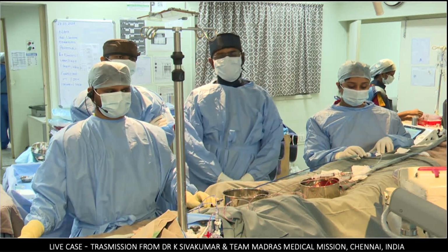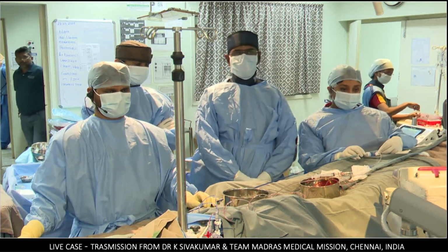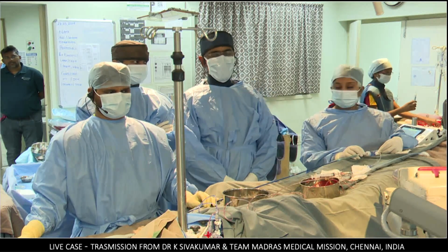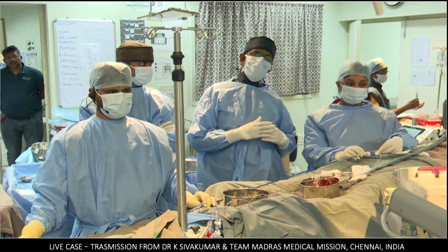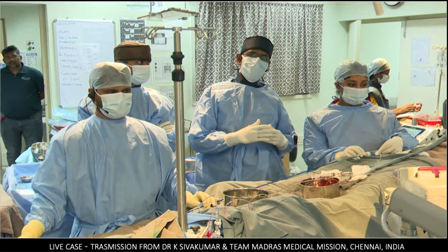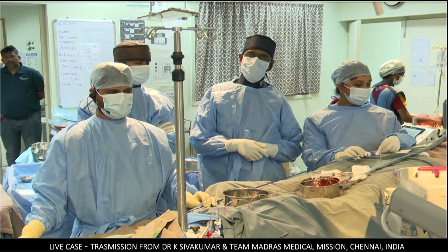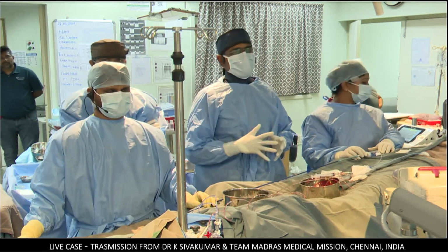The balloon size was 32 millimeter, and so we normally go for about +4. So we decided to go for a 36 millimeter. The main pulmonary artery was very large and very roomy, so we decided to go for the longer valve. And so our plan is to go for a 36-30 Venus P valve.